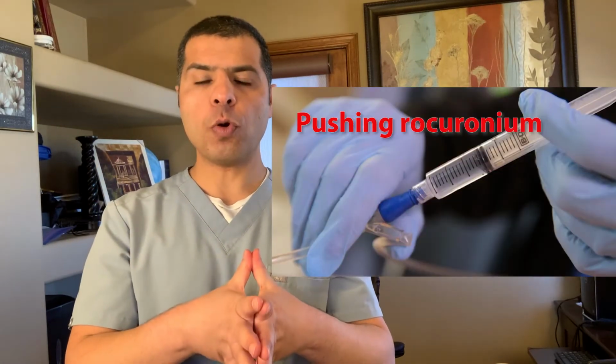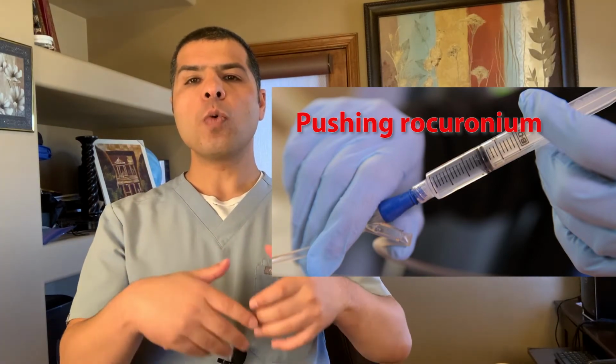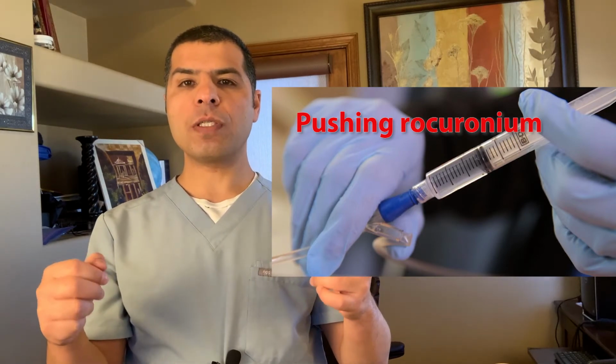In my case, I pushed paralytics without a semi-awake look because I felt I was going to be able to intubate him quickly. So I told the nurse, go ahead and push rocuronium. See, the nurse should only push this medication when you tell them so, because it happened before and I've seen it where you tell the nurse the medications and the next thing, the sedative is pushed and the paralytic is pushed. So make it clear to them when you say I need etomidate and rocuronium, please don't push it until I tell you so.